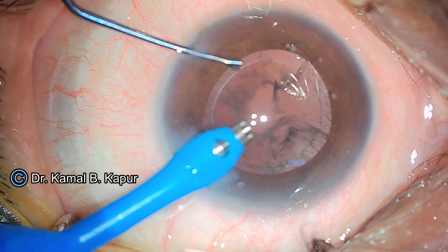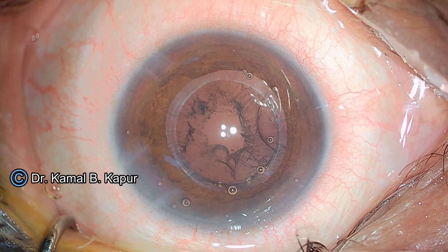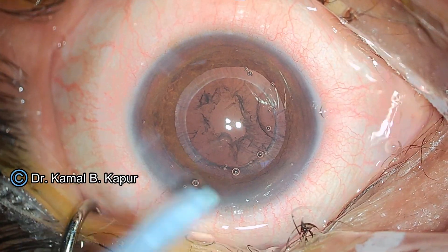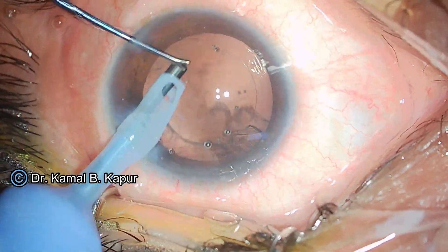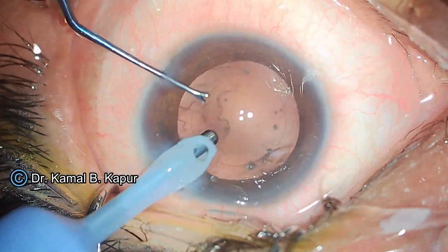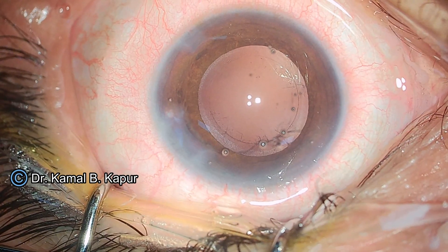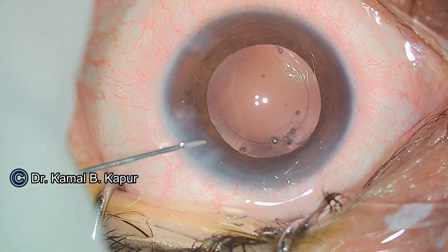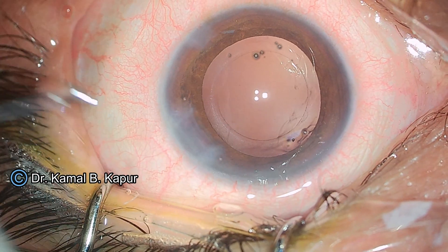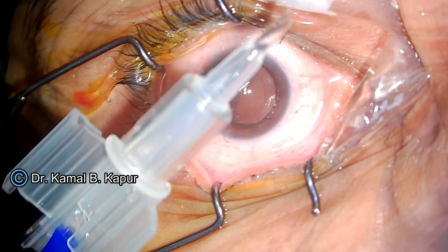The intention is to show the insertion and procedure of using the Lux Smart injector. One important point I would like to reiterate is that especially when using premium IOLs, it is a very good idea to do a very clean cortical cleanup and ensure that the posterior capsule is very well polished. You will see us using a hydrojetting technique to clean the posterior capsule, resulting in a pristine clear posterior capsule.